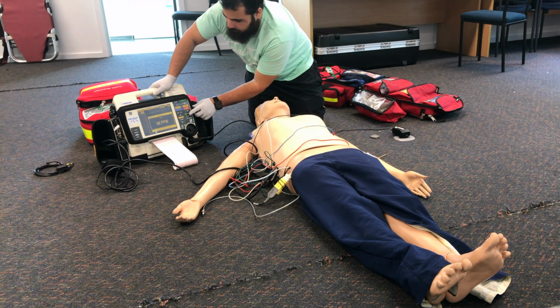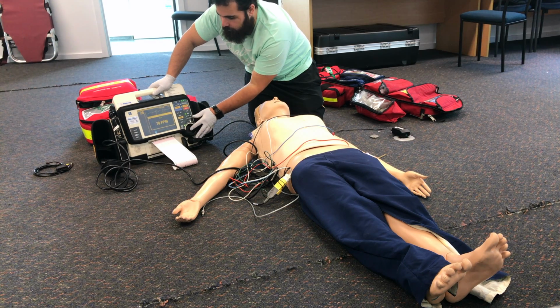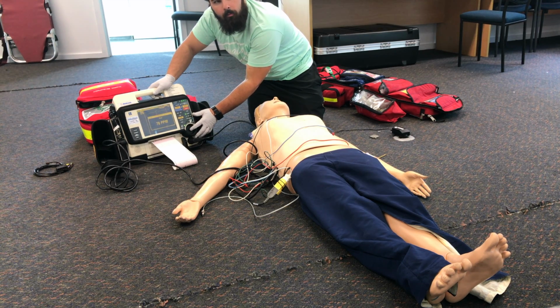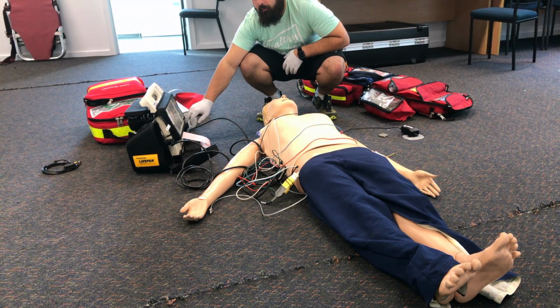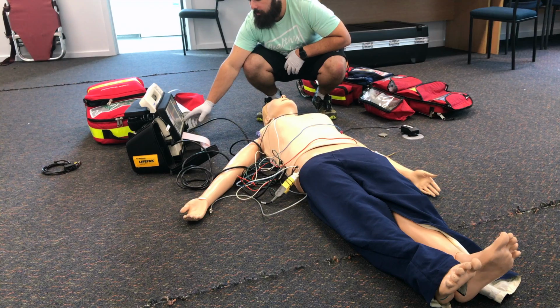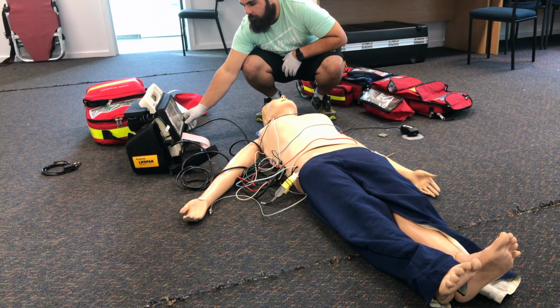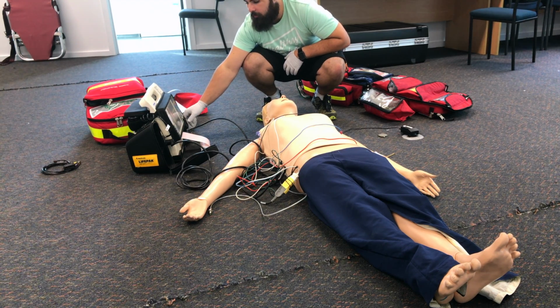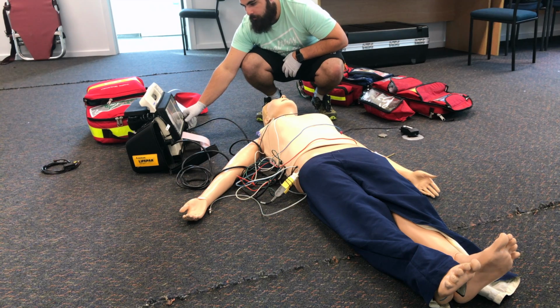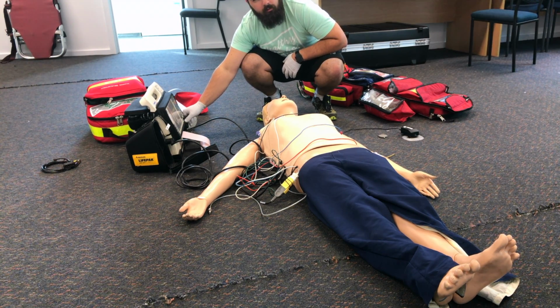I'm going to press the pacer button. I'm going to set the rate to 70 per minute. I'll set the current up by increments of 10 milliamps until I confirm capture. So we're up to 60 milliamps, and I can now confirm that there's a detection symbol above each QRS, as well as a pacing spike before each of the complexes.